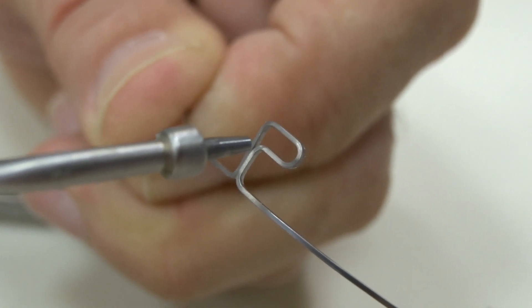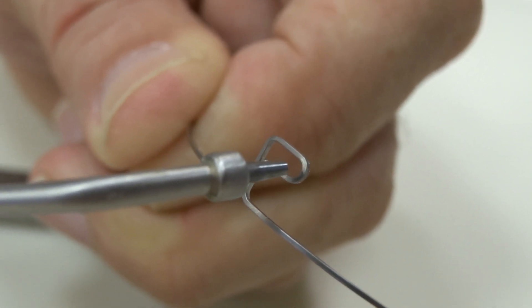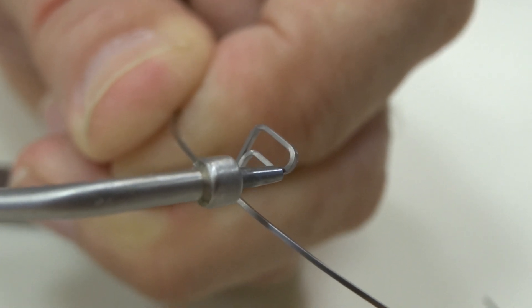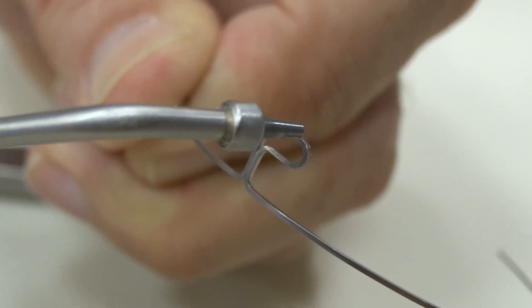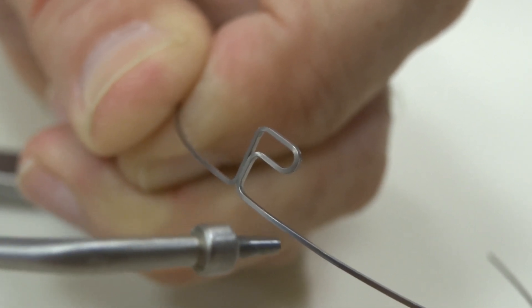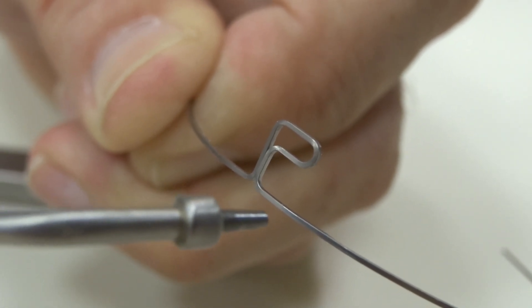For example, if we wanted to make a step-down in torque, intra-orally I could place a Weingart at this angle, or I could place it at this angle and squeeze. That would allow this anterior portion of the wire to step down and torque.